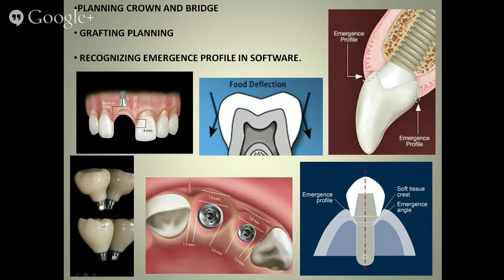The picture on the bottom left just shows the difference between the crown design. This crown is going to be a lot more difficult to maintain. It has an overhang that you see here, and that overhang was made to allow this crown to be built out to be in line with the adjacent facials of the tooth and carried down to the gingival, but it also is very bulky here. And at this point of the crown right here, there's a little bit of a concavity.